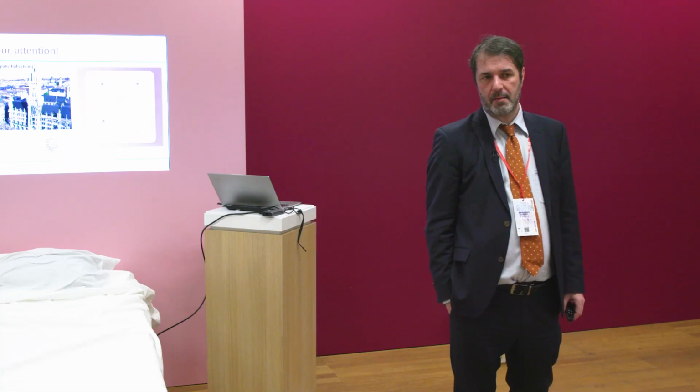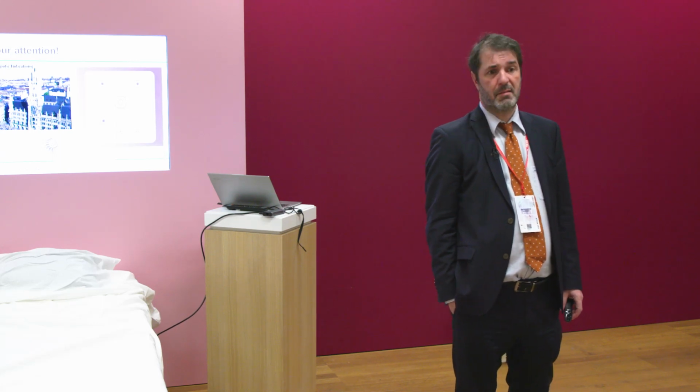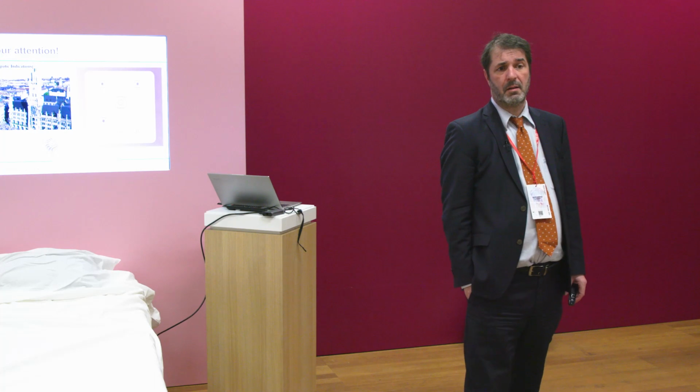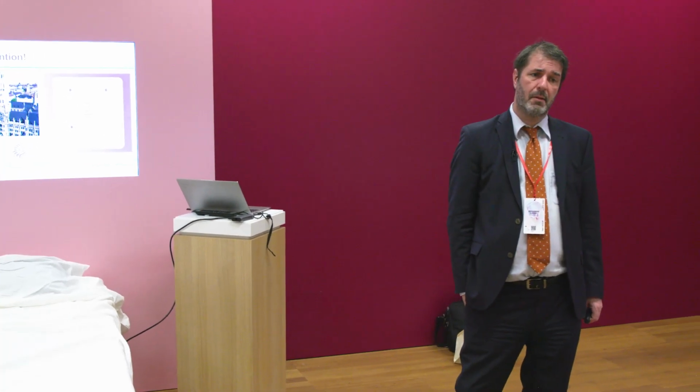Well, I do have a question because it looks so obvious that it works to compare images, and so the basic of fusion imaging, compare imaging to make your diagnosis. But is it already something that is done in the hospitals? Yes. Because it looks obvious to do that when you're not sure about your diagnosis. You compare it with another, if images are available.